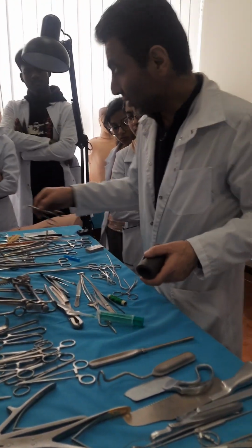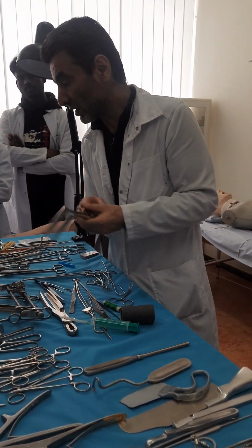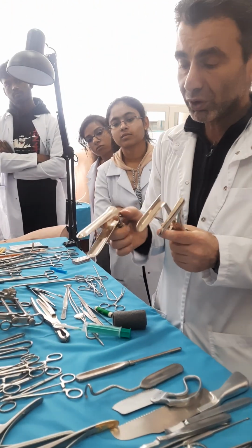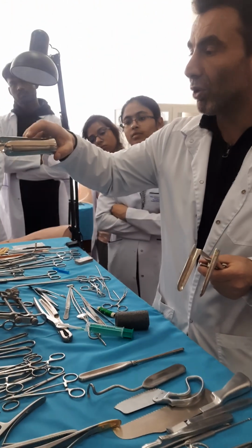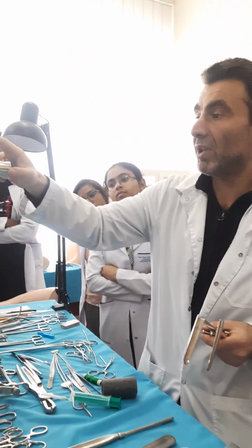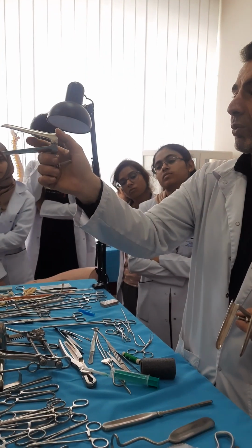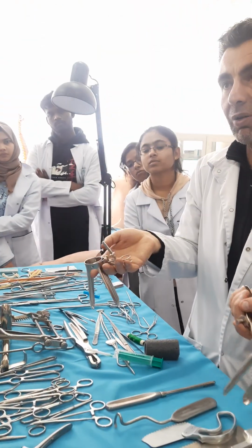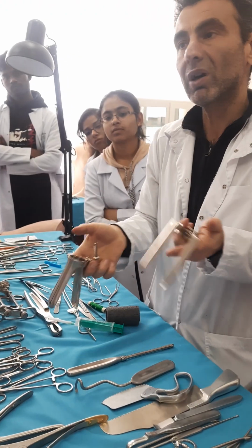According to it, guys, and all other instruments, for example, you can see the rectal mirrors, you can see vaginal ones a little bit bigger. You apply it how you want. For example, you know that the surgical field will be upwards. You will apply it in that way. If the surgical field will be on the right side, you will apply it in this way. Here we have a lock. You open it as much as you need, or this kind of lock.